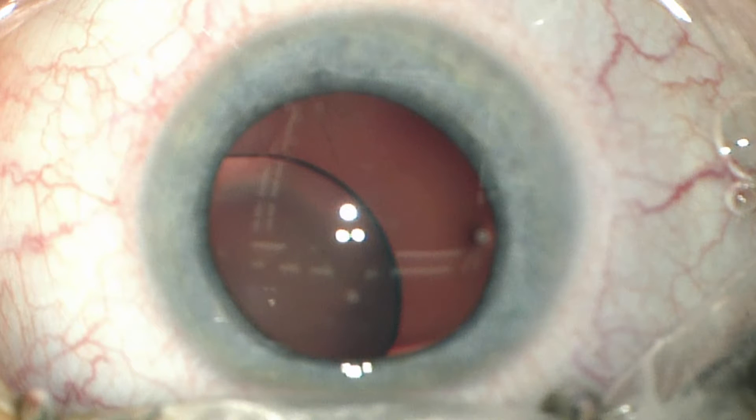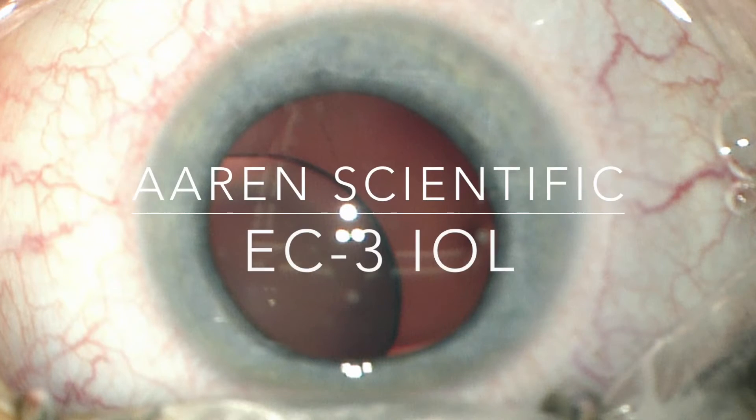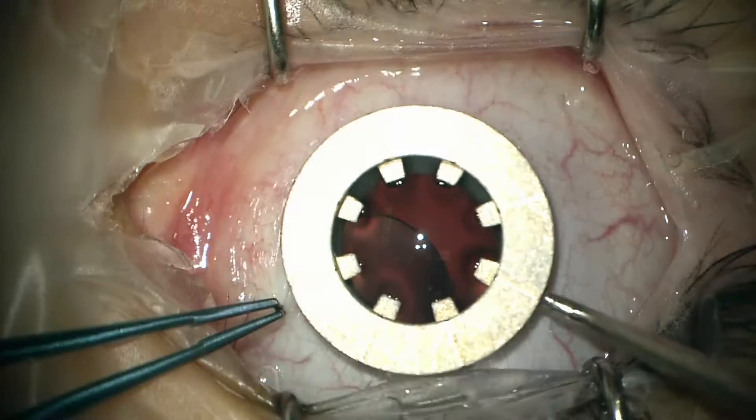In this video, Vinay Shah and I are removing a dislocated crystalline lens in a patient with Marfan syndrome, and then placing a secondary lens via the haptic tuck technique.